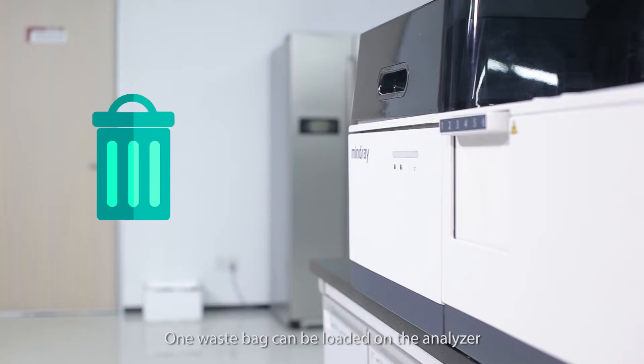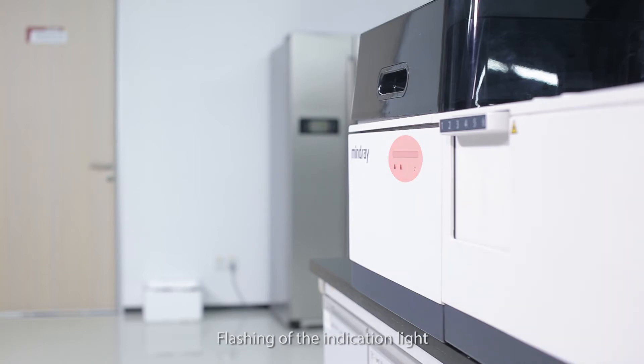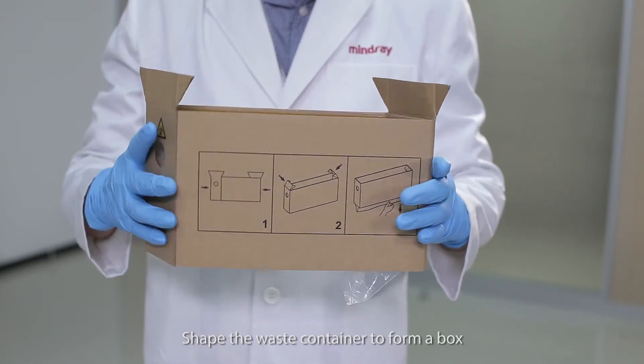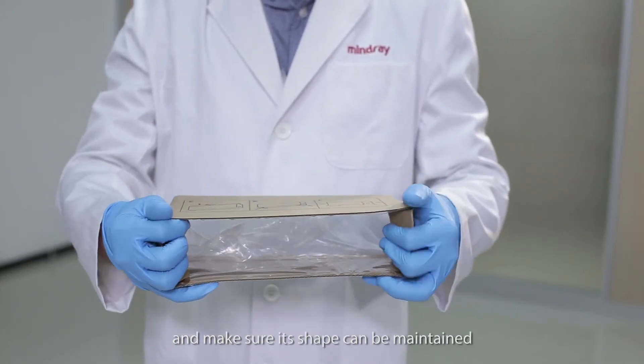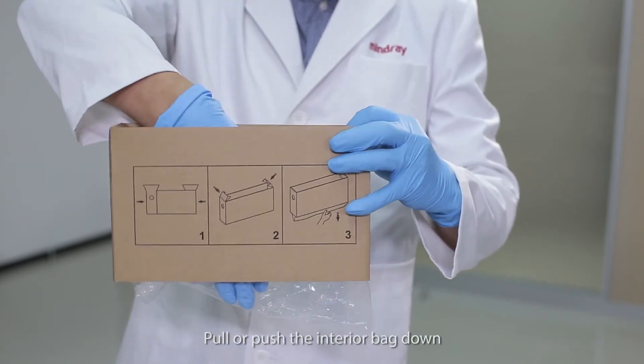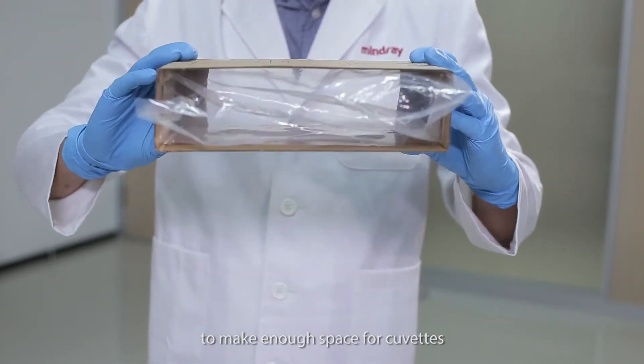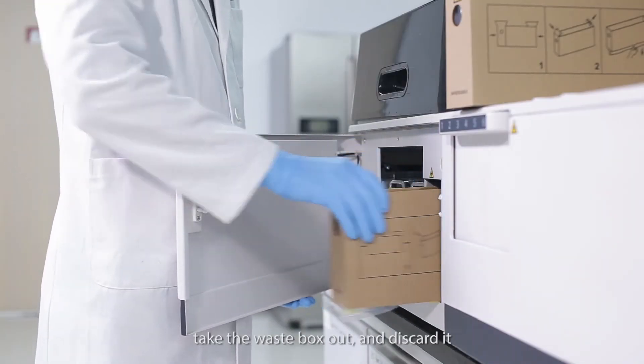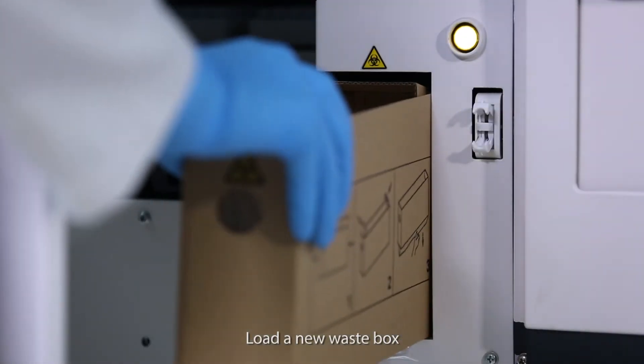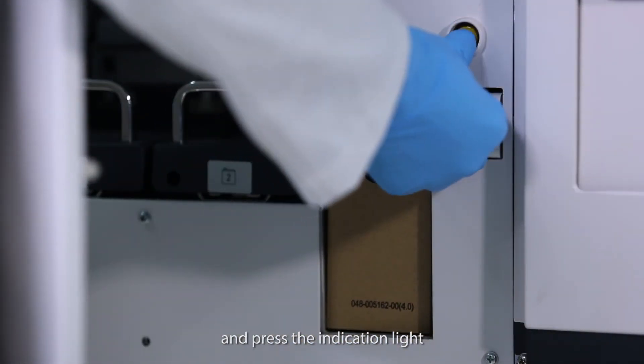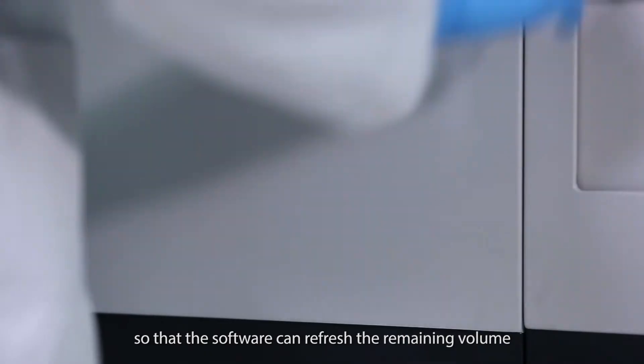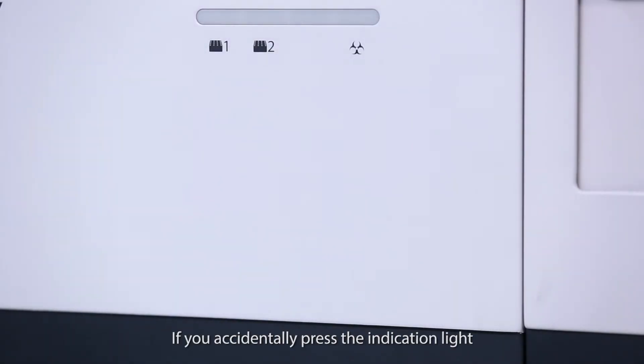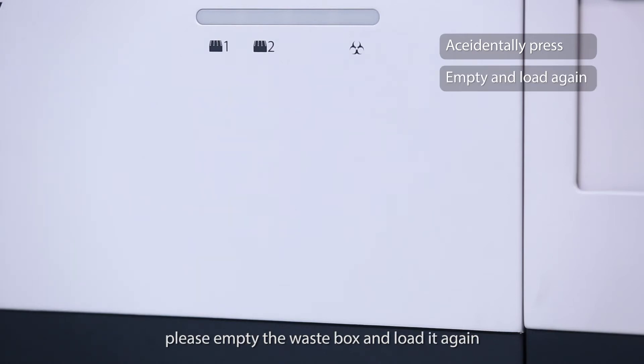One waste bag can be loaded on the analyzer. Flashing of the indication light means it needs replacement. Shape the waste container to form a box and make sure its shape can be maintained. Pull or push the interior bag down to make enough space for cuvettes. Open the door, take the waste box out and discard it. Load a new waste box and press the indication light so that the software can refresh the remaining volume of the waste box. If you accidentally press the indication light, please empty the waste box and load it again.